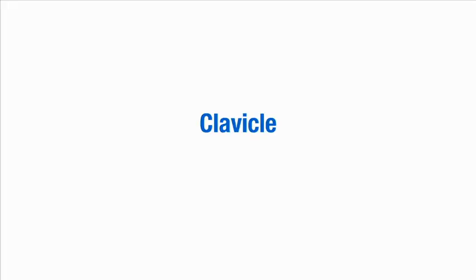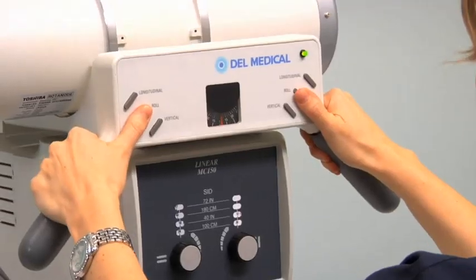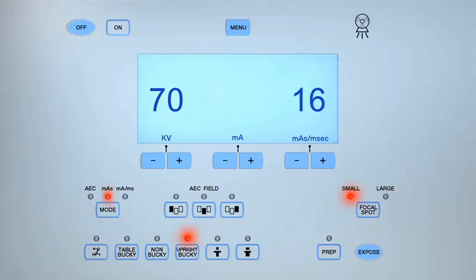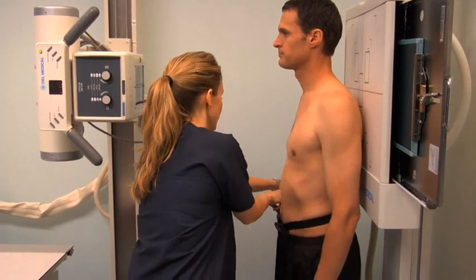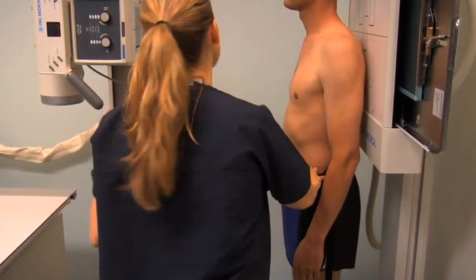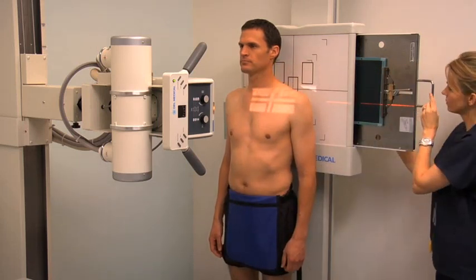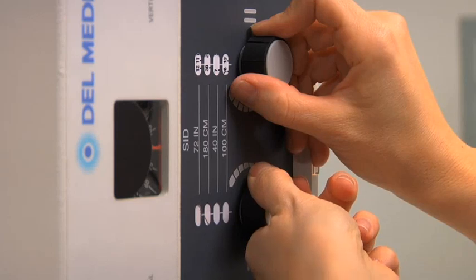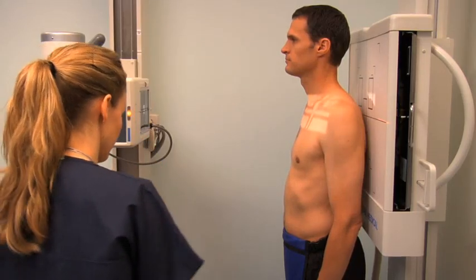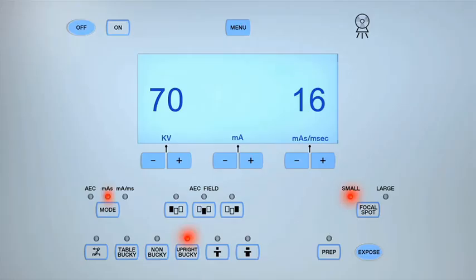To obtain a radiograph of the clavicle in the AP upright projection, select a 10-by-12-inch cassette and place it in the upright bucky. Set the SID to 40 inches and align the central ray perpendicular to the image receptor. Set the exposure parameters to between 60 and 70 kV and 12 and 16 MAS. Ask the patient to stand with the posterior aspect of their shoulder against the image receptor. Position the protective lead shield over the front of the pelvic area and ask the patient to look straight ahead, checking that their shoulders are symmetrical to the image receptor. Center the central ray to the mid-shaft of the clavicle and adjust the upright bucky to the central ray. Collimate the light field to include the sternoclavicular joint, the clavicle, and the acromioclavicular joint. Place a left lead marker above the patient's left shoulder within the field of collimation.